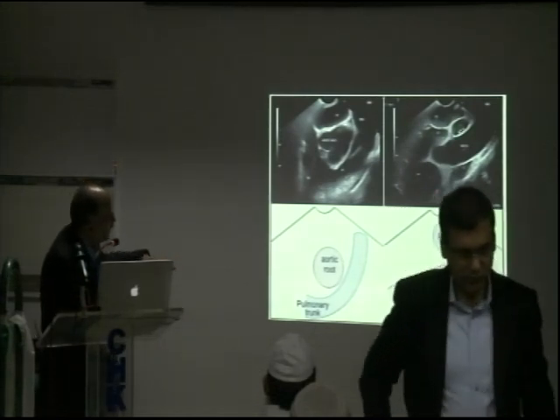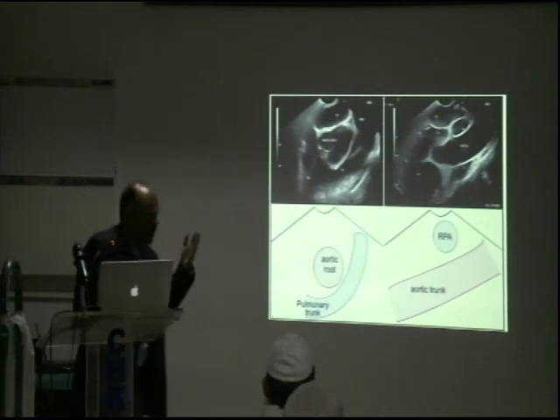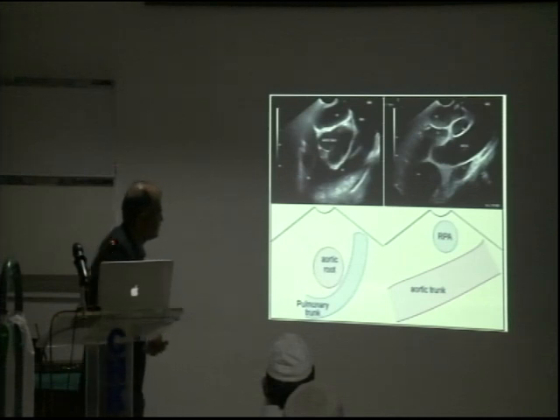So now if you're facing towards the arch of the aorta, and if you rotate the scope like this, what would you see? This is pulmonary artery, aorta, LV. This is the mediastinum, right? So you're facing now anteriorly. So if you turn clockwise, where would the scope go?